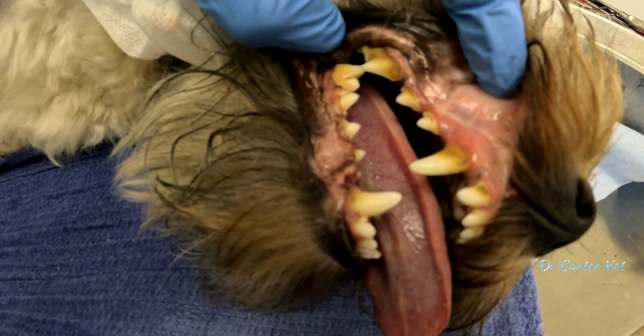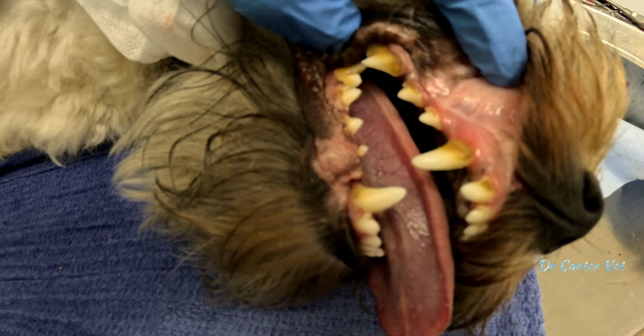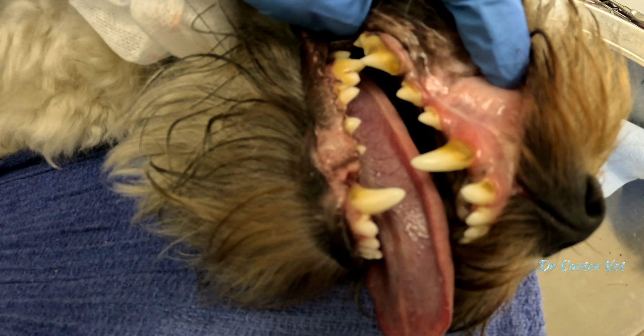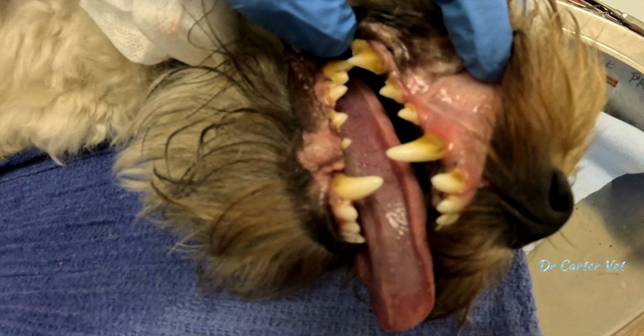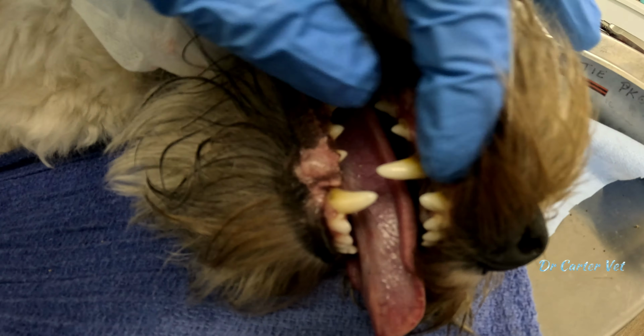Over a period of time, this is a relatively young dog. We expect to see this in an 8-year-old dog. This is a 4-year-old dog, but it can get significantly worse over time. With cleaning every few years, we'll sort it out. Let's see how it goes.